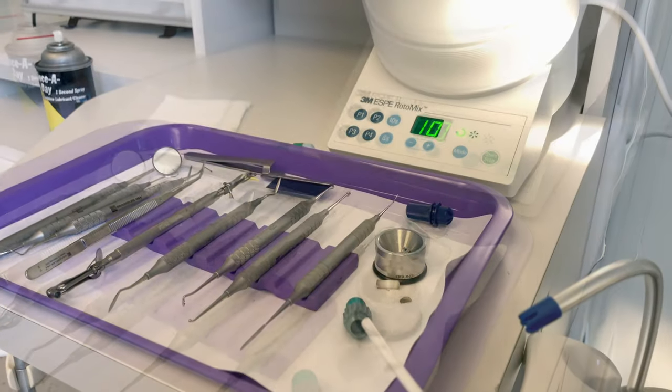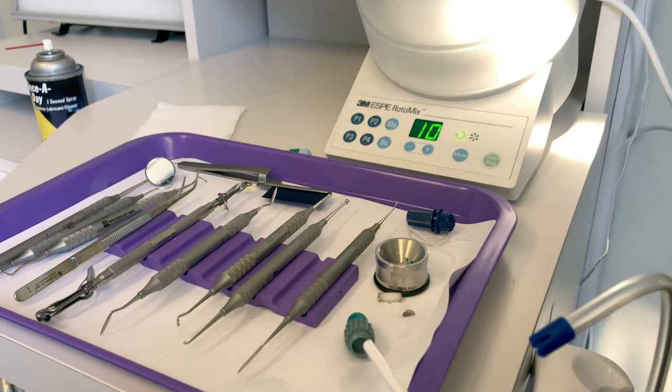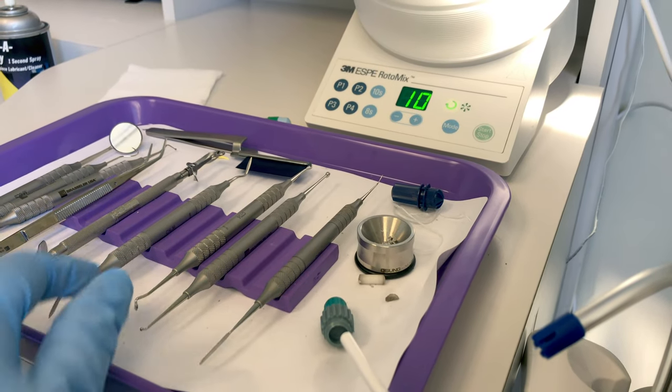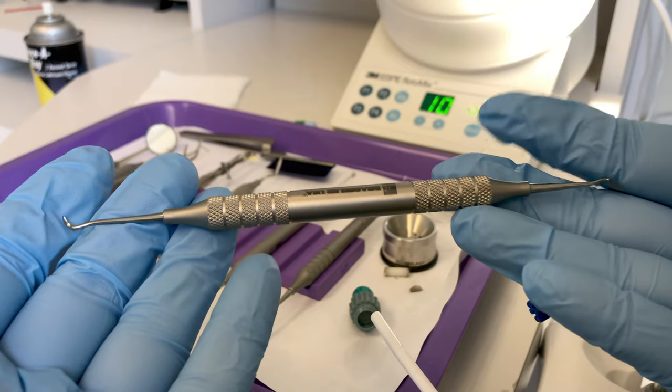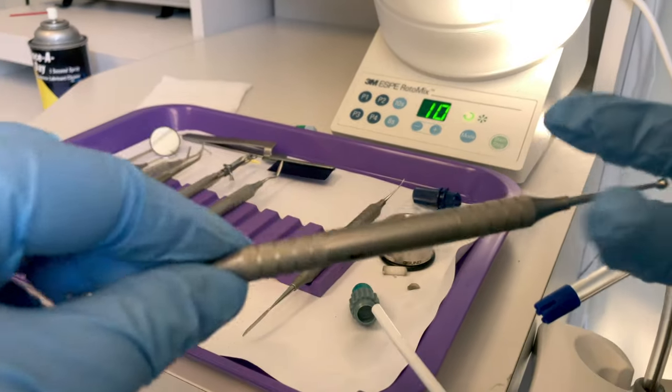Now that the amalgam is in place — it's actually overflowing — the doctor needs to carve the anatomy back into the tooth. Depending on your doctor's preference, they're either going to start with an occlusal carver such as a cleoid discoid or a Tanner carver, but some doctors prefer using a burnisher to start. We have a ball football burnisher. I'll use the traditional method — carver first. Take the old instrument and deliver the carver in the direction of use.